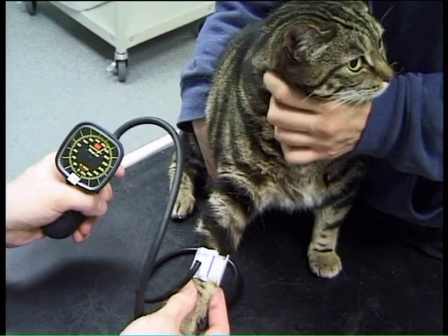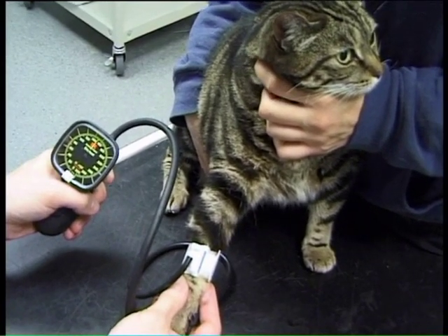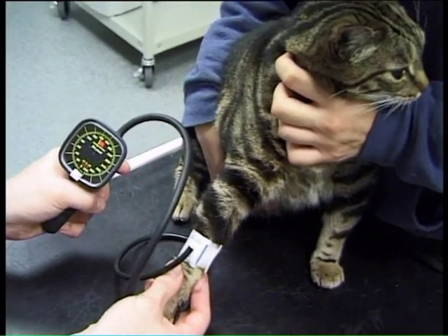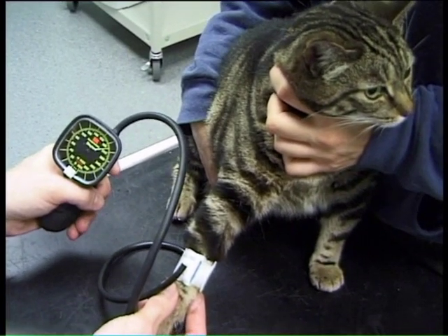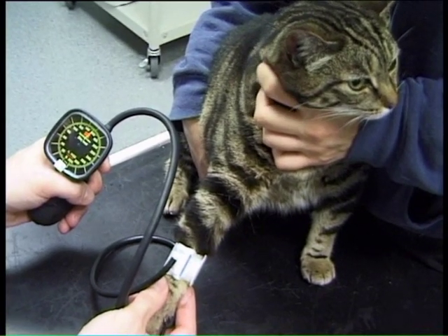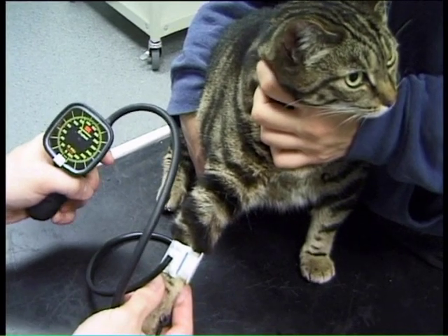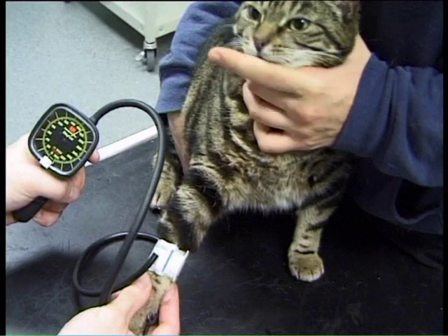We do this consecutively around five times, inflating the cuff to around 20mmHg above the point at which you can no longer hear the blood flow, and gradually deflating the cuff. That point where you can first hear the blood flow again is systolic blood pressure. We do it five times, and ideally each of those readings should be about the same.